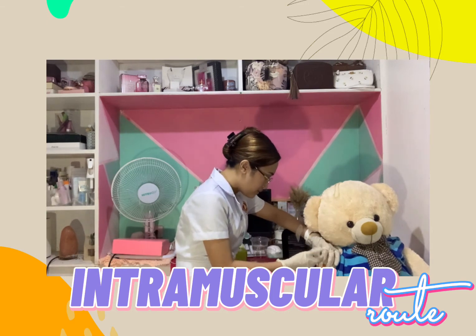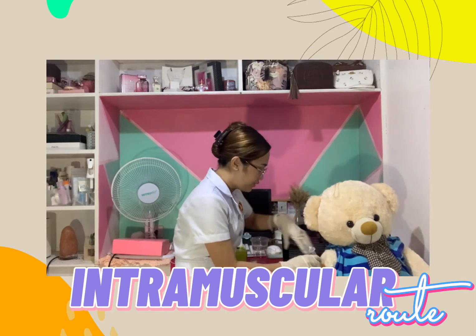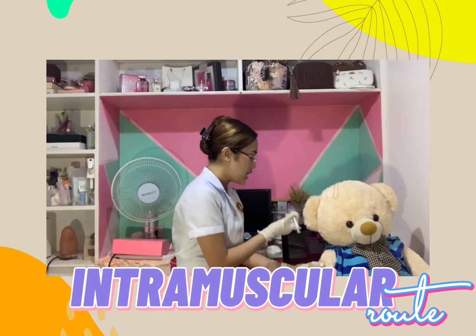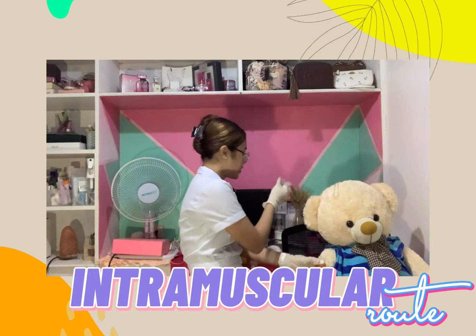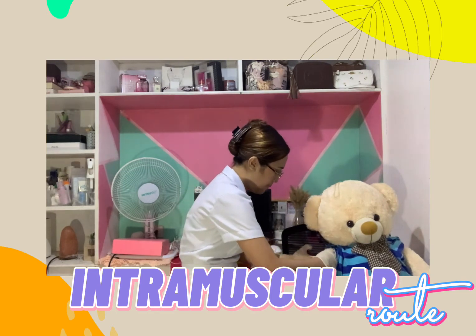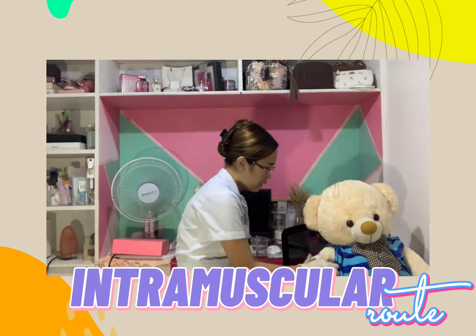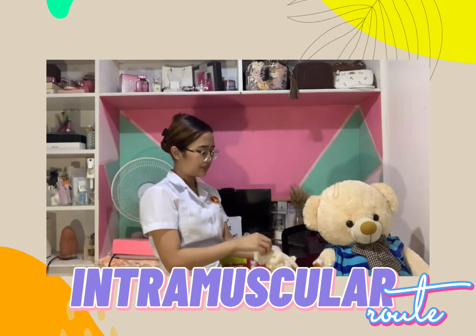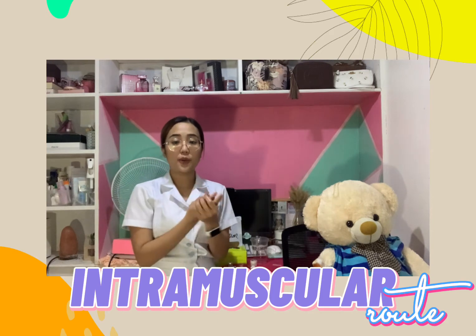So, after administering, we will remove the syringe, release the Z-track motion, and put on the cotton balls with a gentle pressure. Discard the syringe in the sharps container. You can put micropore tape. And then, after that, we can now remove our gloves, perform hand hygiene, and then we can document the procedure.